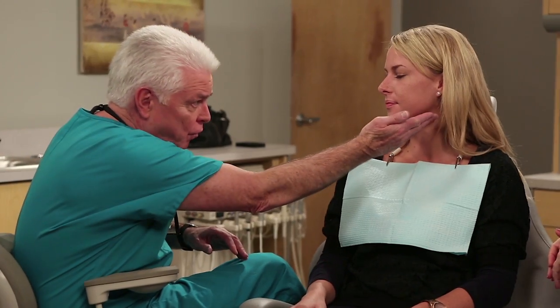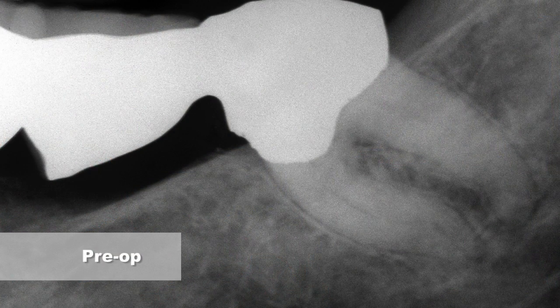This is Dr. Cliff Ruddle. I would like to show you how to use the ProTaper Next instruments clinically. As with any endodontic procedure, it all starts with an accurate diagnosis. Diagnostics is comprised of gathering your clinical findings, performing the vital pulp testing, and of course, attaining one or more well-angulated films.